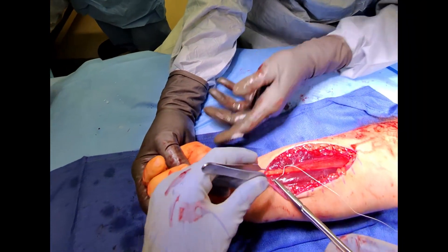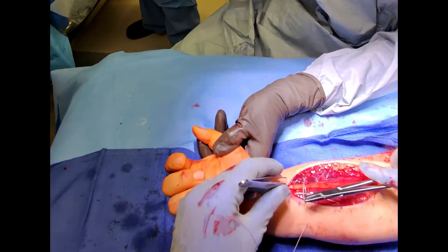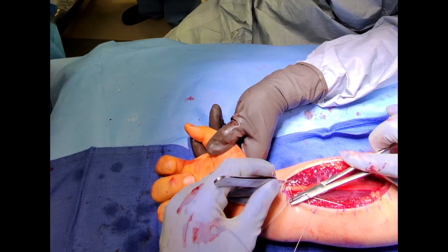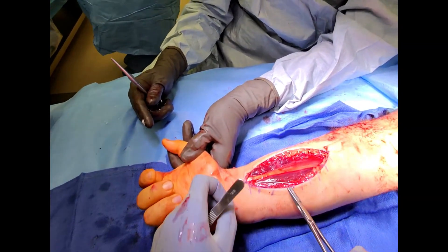We close the incision using a dissolvable suture to approximate the deeper tissues. Once this deep layer is closed, we use a non-absorbable nylon stitch on the superficial layer to conclude the radius fracture surgery.